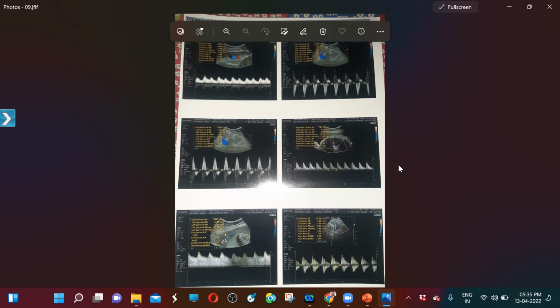Now see what is happening over here. The point here is that, first of all, where is the uterine artery? I suppose that this is the uterine artery. Let me zoom onto this. Here, this is the uterine artery. Now, in the uterine artery, I am having some mild notching, not a very prominent notching over there.